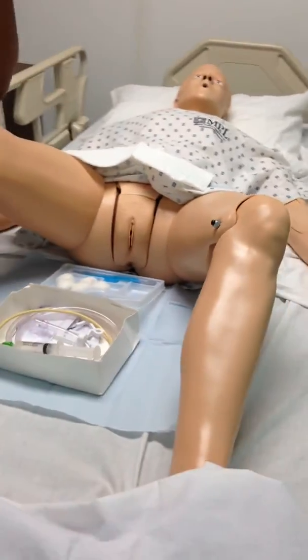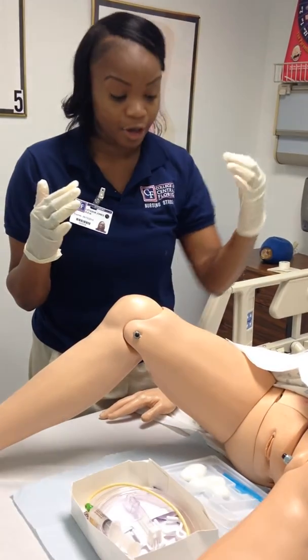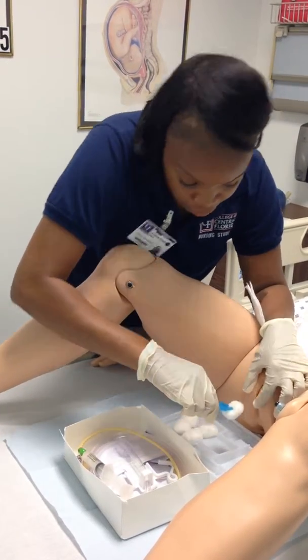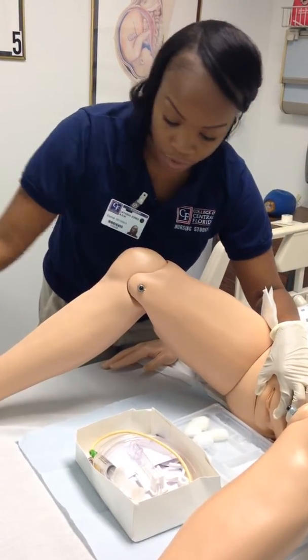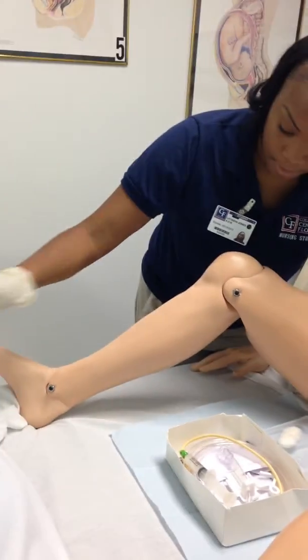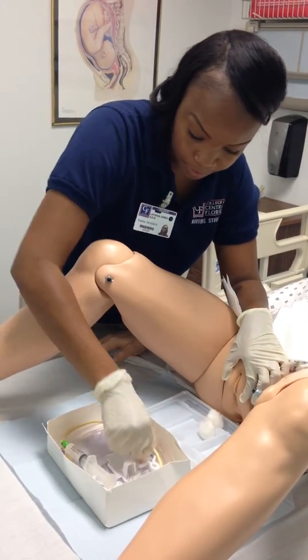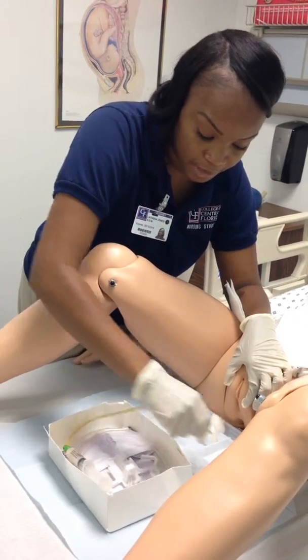Now I'm going to put one hand over her pubic symphysis and in a C shape open up her labia majora and her labia minora. Going to go ahead and clean the farthest labia majora, labia minora. One wipe, come back over, throw it away. Clean the other side and down the middle. I'm just going to lube the tip of the catheter.